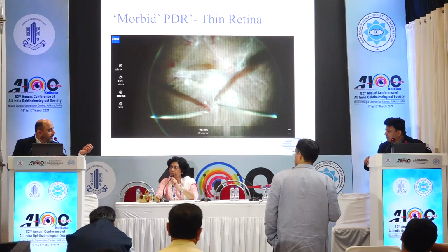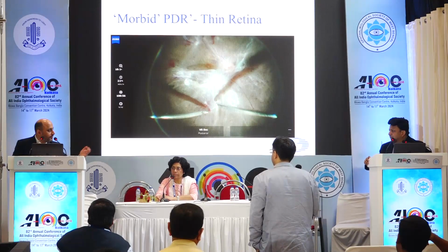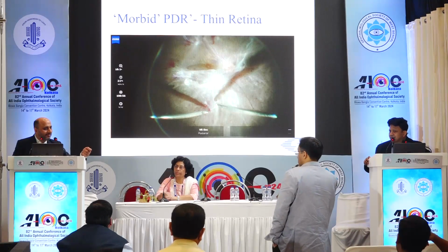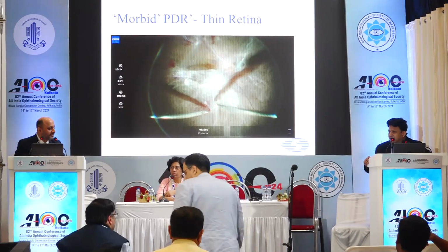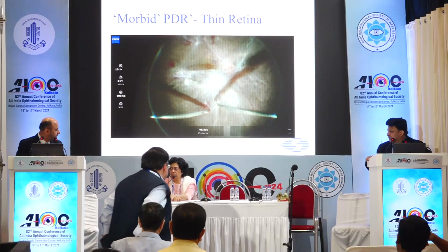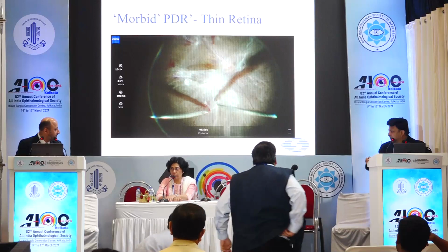But even in cases like the combined detachment that you showed, you go with the same settings? Because we usually have that feel of same settings. See, if you keep it low, it won't be successful. Nowadays, with this MIVS, the retina remains stable. It does not jump so much.